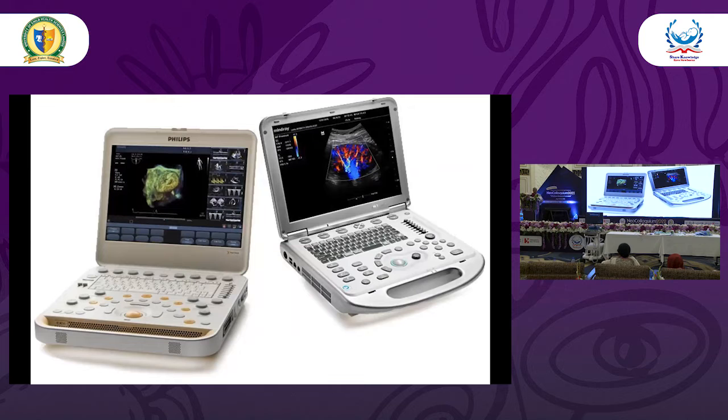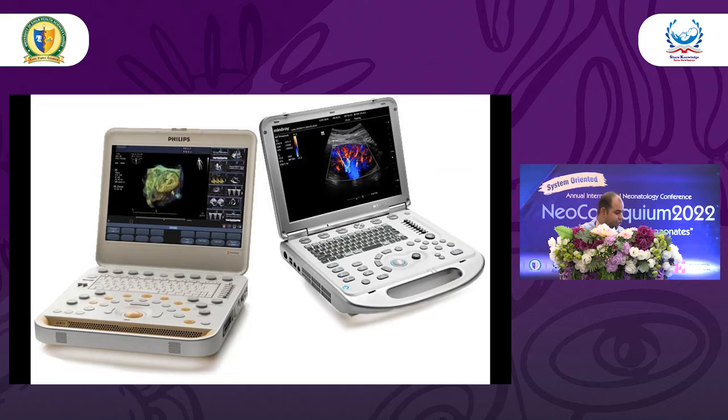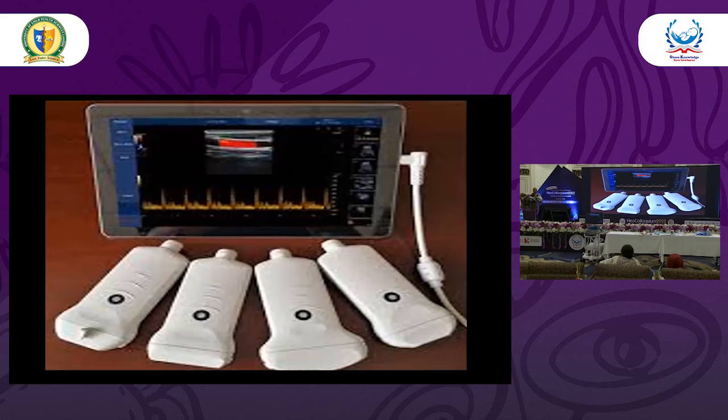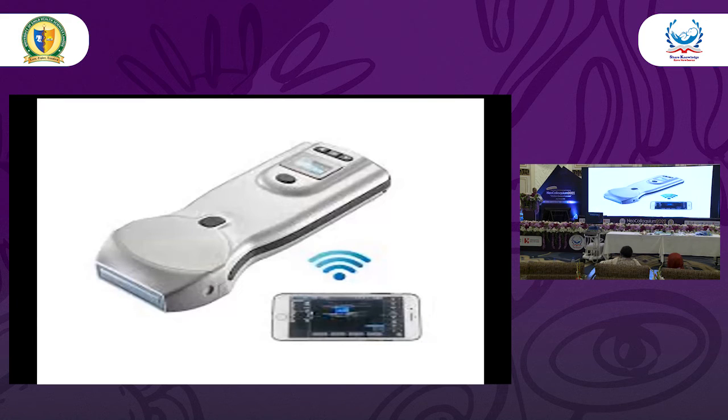Nowadays, these are the ideal machines which have been shown for vascular bedside or even ICU settings for ultrasound-guided procedures. These are handy to carry, can be placed easily on the bedside, and are easy to manage. Certainly, there are now machines which can be carried in a pocket or even a small bag, just like these. These are tiny pocket-held machines, and we also label them as handheld machines.